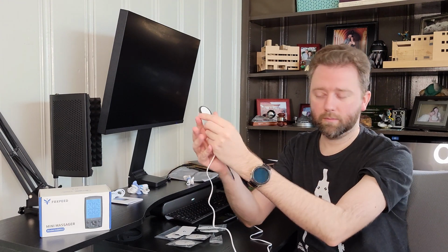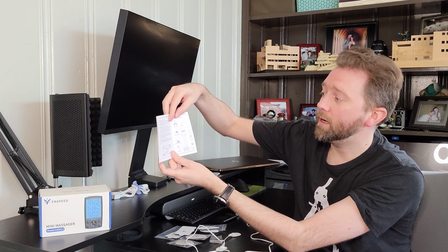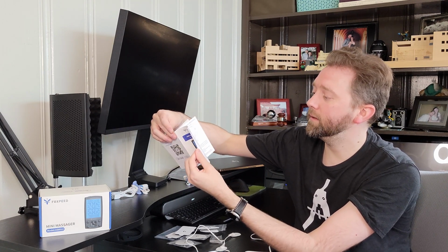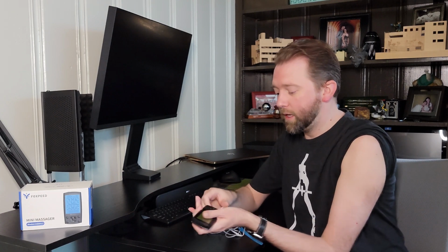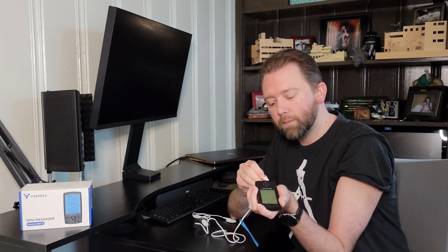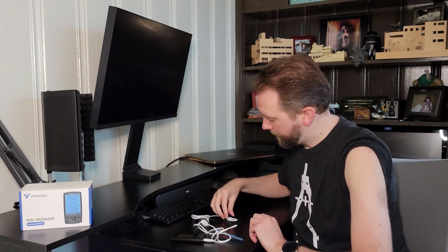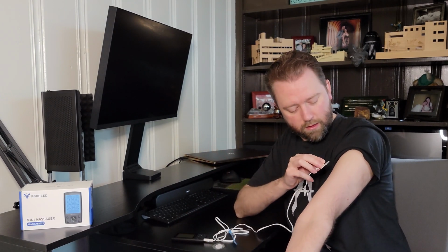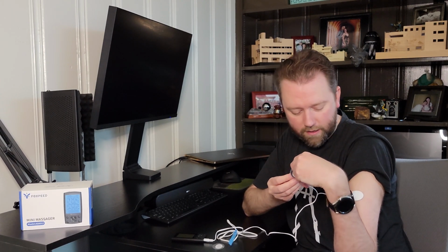Now, you just apply them on your arm. Like I said, if you need ideas or tips, look at the manual. They give you little ideas of places to put them on. All right, well, let's hook this up and show you how it works here. So just plug it in. If you got the one channel, I'm going to plug it into A. If you got the 2 cords or you have another person, you can plug that into B. Then just snap them on here on the ends, the little pads. And then just make sure it's where you want it. So I'm just going to put it on my arm here for now so you guys can see.